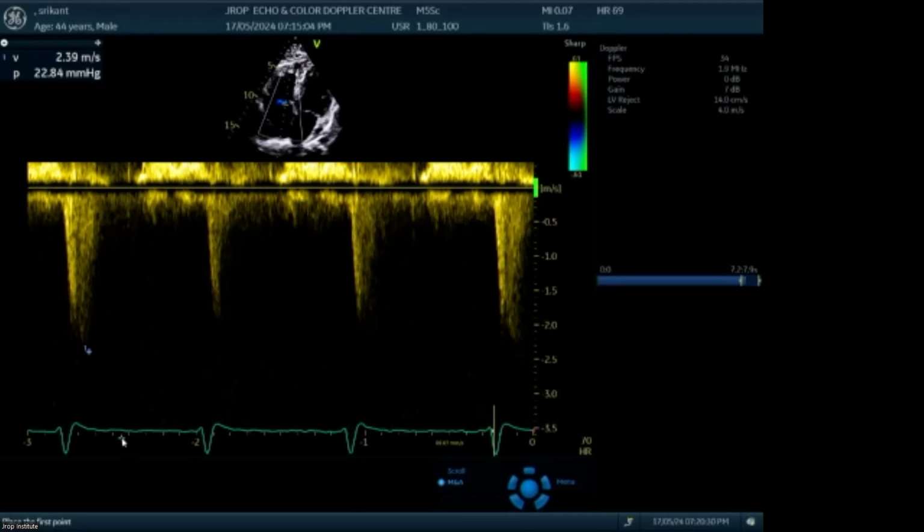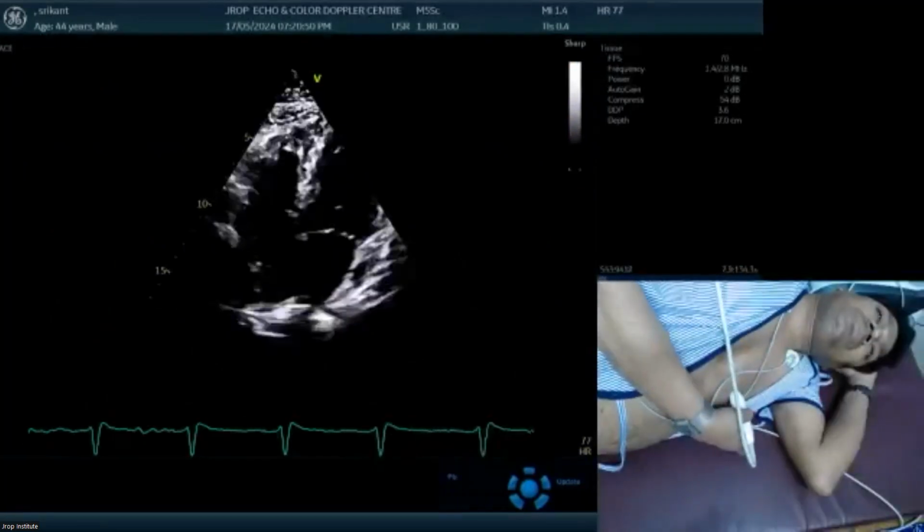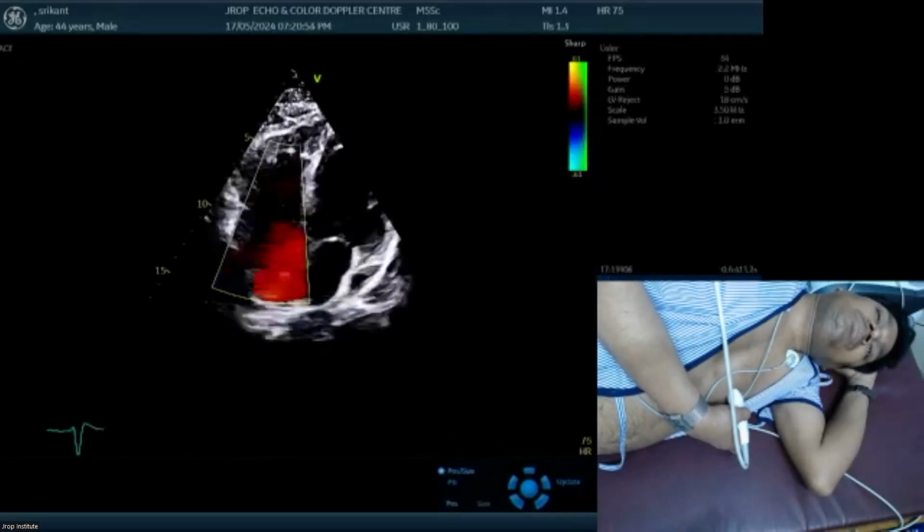Dr. Ravi Bala Mahajan: Sir, what is vena contracta? Vena contracta is a hole through which the blood is regurgitating back from one chamber to another chamber. So, in this subject, the word vena contracta is concentrate on tricuspid valve. Don't concentrate anywhere else.